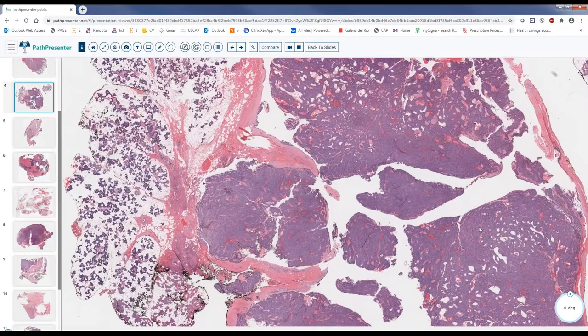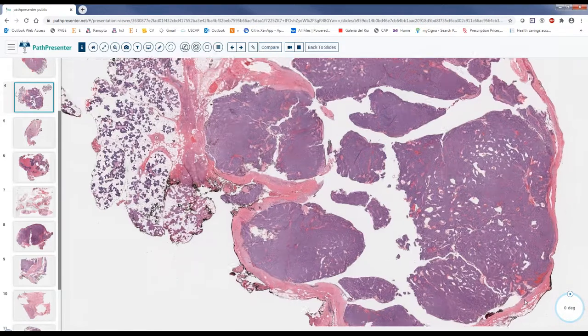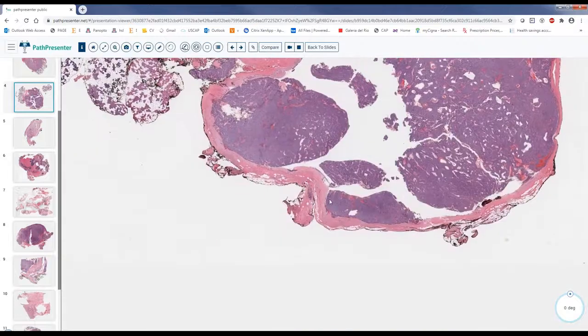Okay. Again, you don't overkill by giving 50 sections. Focus on the capsule more. Okay. And you should be very comfortable with the capsular invasion. Like you'll see, there is really mushrooming into the tissue surrounding it, not just an area here just going through.